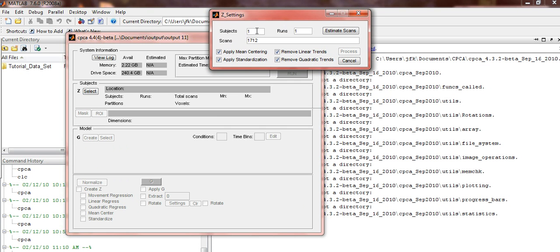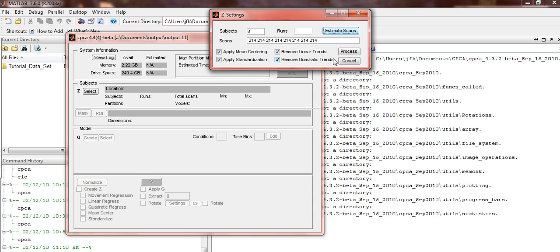In the Subjects window, type in 8. Runs 1, click Estimate Scans. Make sure that all of these are checked off and click the Process button.